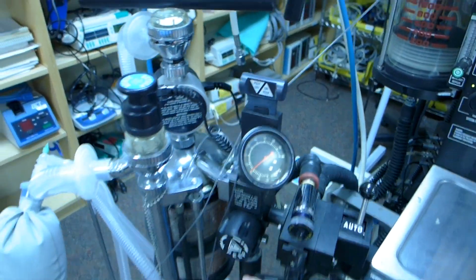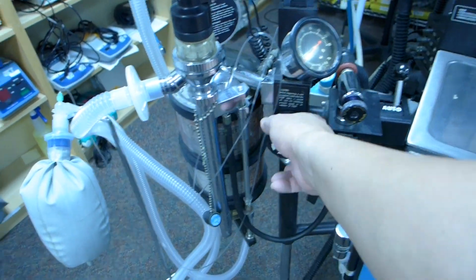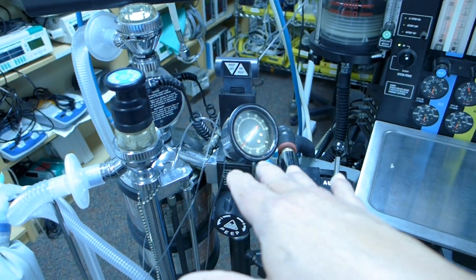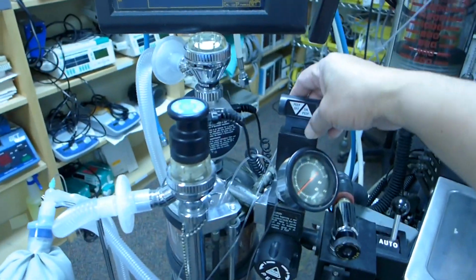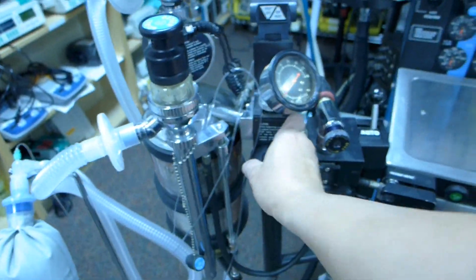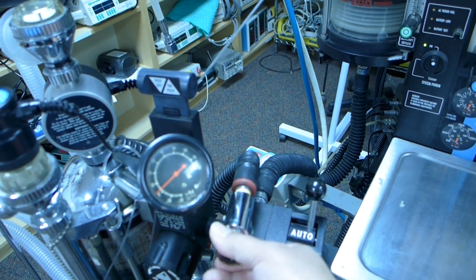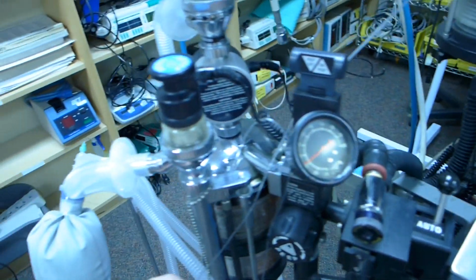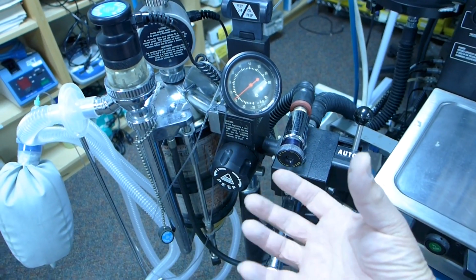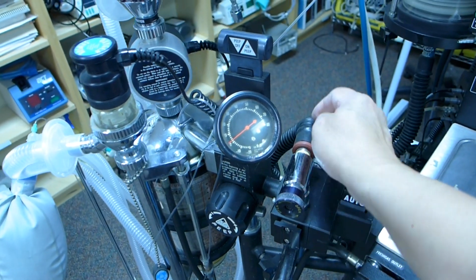And then we have the PEEP. This one is positive end expiratory pressure. We can set PEEP to have the gas continue flowing to the lungs. We can turn the PEEP off or on from here. So we have the PEEP device over here, and also this pop-off valve. This creates a kind of compliance or resistance to the lungs when we are bagging the patients. That's how much we want to let the air escape to the scavenger system.